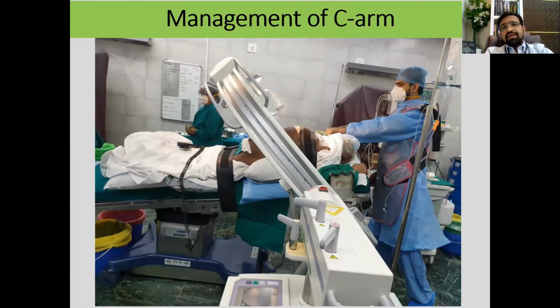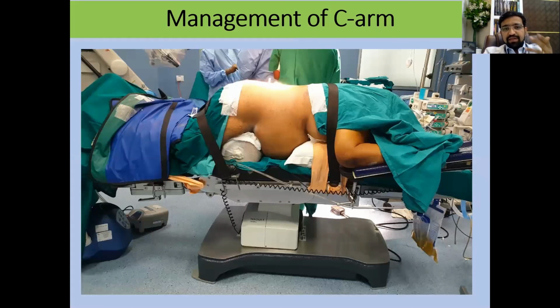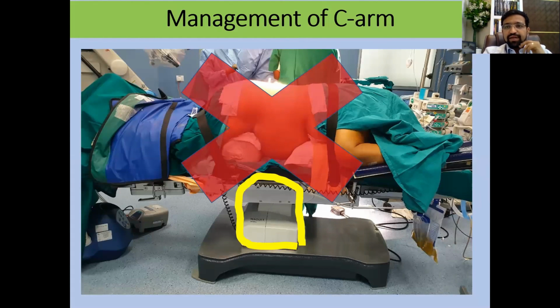Another important point is that your C-arm management should be precise and well thought out before you start draping. Sometimes you get these extreme angles with the C-arm, but if your positioning is correct, it should not be a problem. You have to have enough distance to look at both AP and lateral and whatever views you want. Especially during an S1 screw, you need those extreme lordotic angles, and the base of the table causes a problem. For example, in this patient, I would absolutely not be able to take an AP view, whatever I try. So this should be planned well in advance.